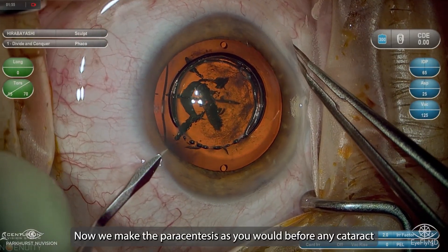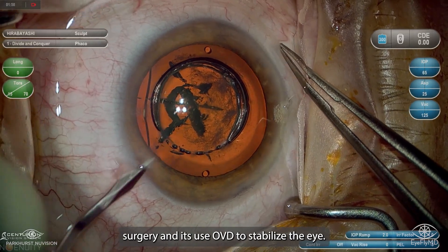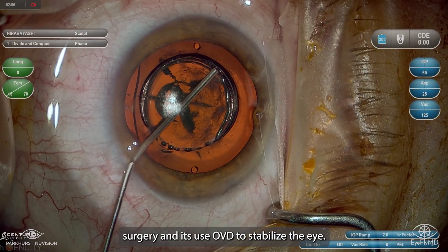Now we make the paracentesis as you would before any cataract surgery, and use OVD to stabilize the eye.